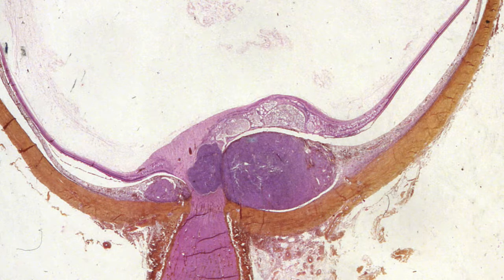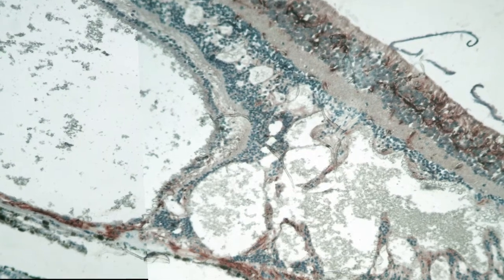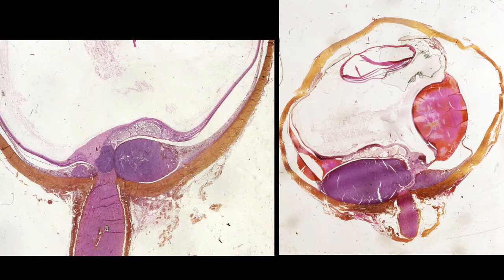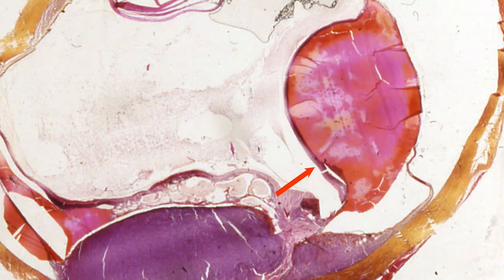The retina is invaded by a large macular edema barely contained by an astrocytic gliosis at the inner edges. There is no Müller cell gliosis. In the example on the right, the macula is this time detached by a subretinal exudate.